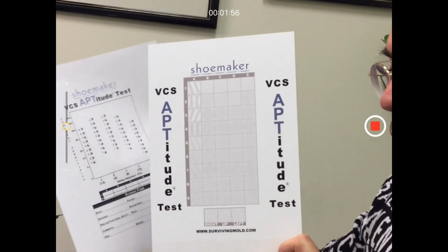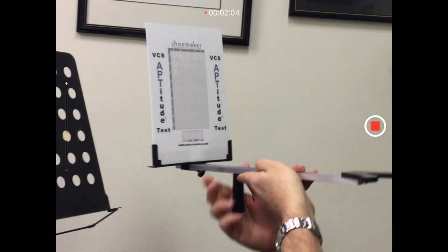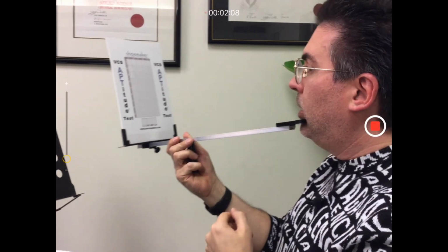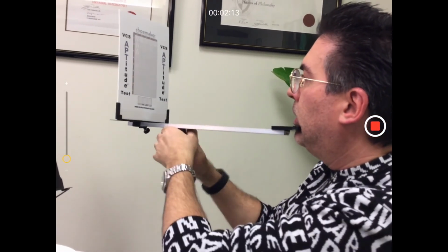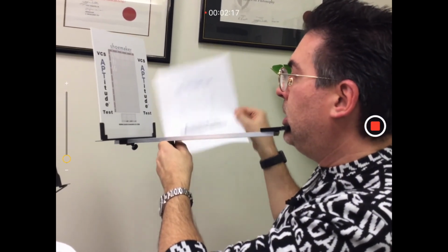So your clinician will be using this type of test card, and they'll ask you to put this together. And Derek, if you can zoom out a little bit, then essentially with one eye covered, the clinician would be recording the results on here.